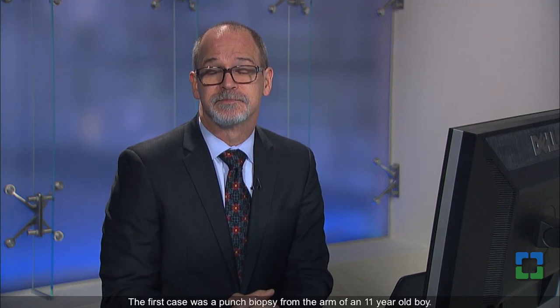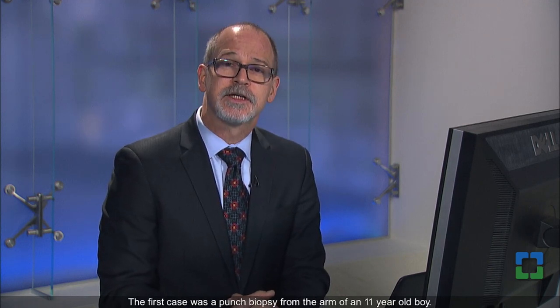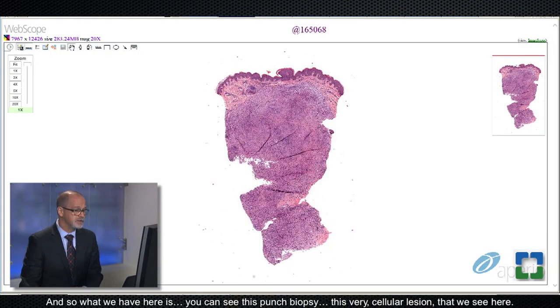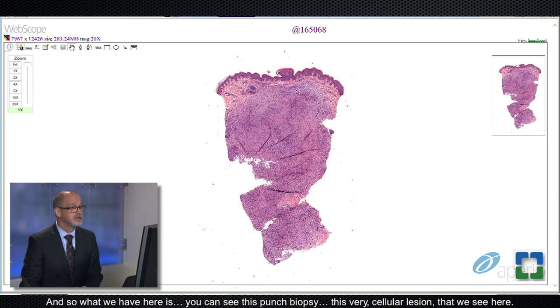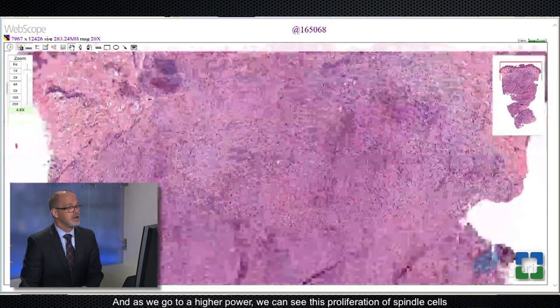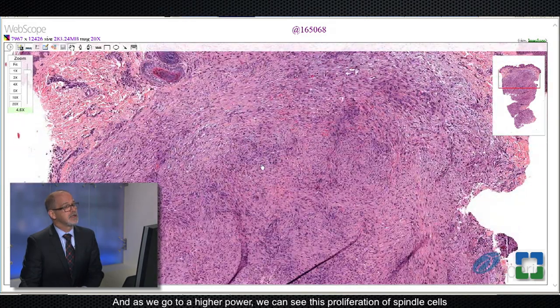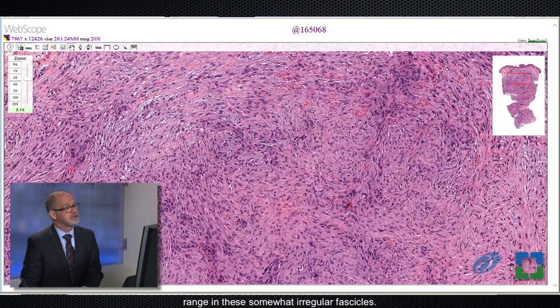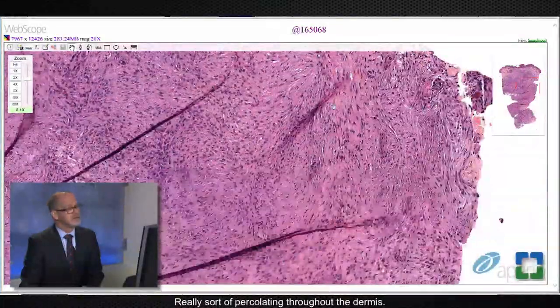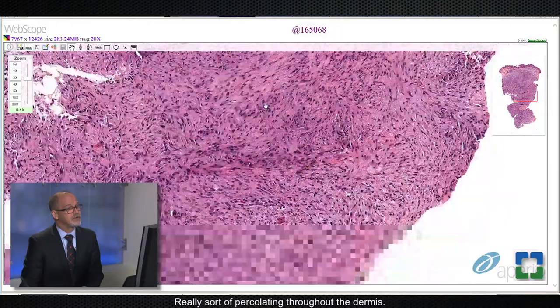We're going to start with the first case. The first case was a punch biopsy from the arm of an 11-year-old boy. What we have here is this punch biopsy with a very cellular lesion. As we go to higher power, we can see this proliferation of spindle cells arranged in somewhat irregular fascicles, really percolating throughout the dermis.